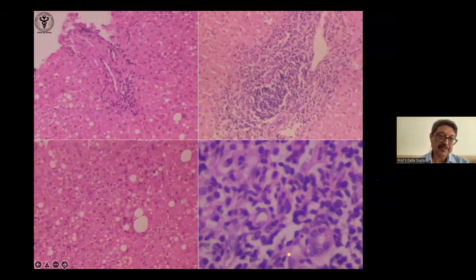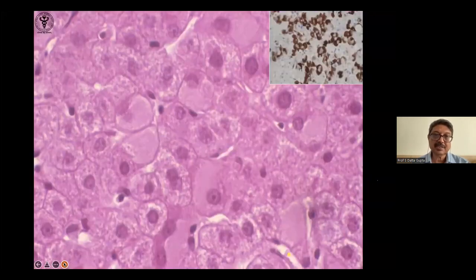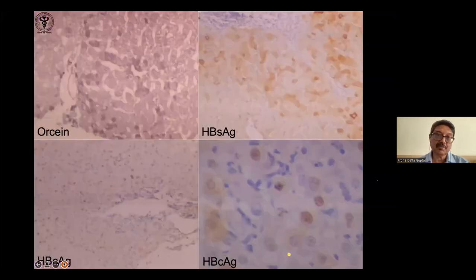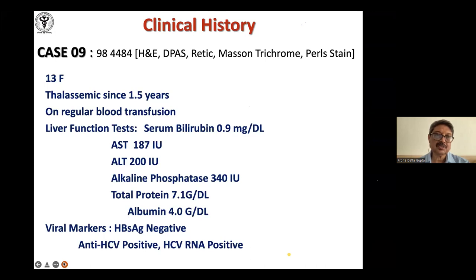You can get fatty change, we see it in about 25% of our cases. Hepatitis B, this is a ground glass hepatocyte. Okay, you can do immunohistochemistry, Orcein stain, and so on. The only things that look like this are after cyanamide therapy, or Lafora bodies. You can do surface antigen, core antigen, and so on.